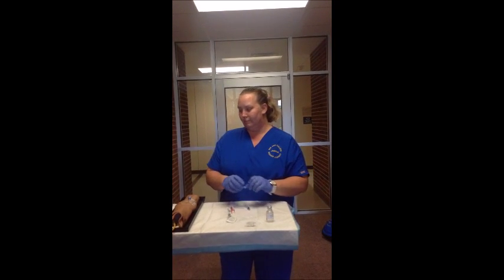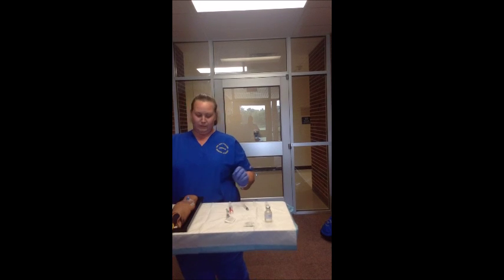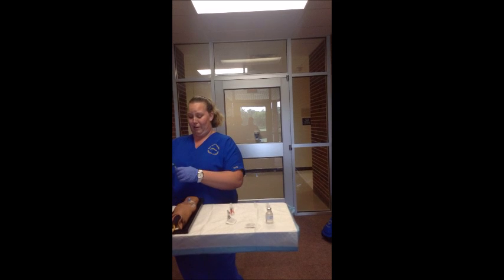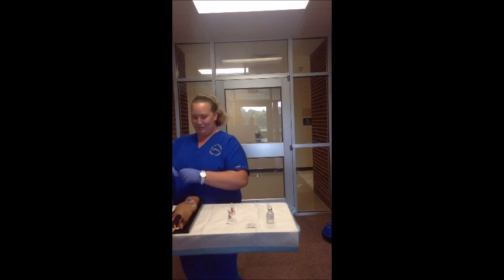And then I will throw this in the sharps, which I don't know if we really are right now. Can I go ahead and do it? Because we're okay now. Okay. You're still practicing with it.